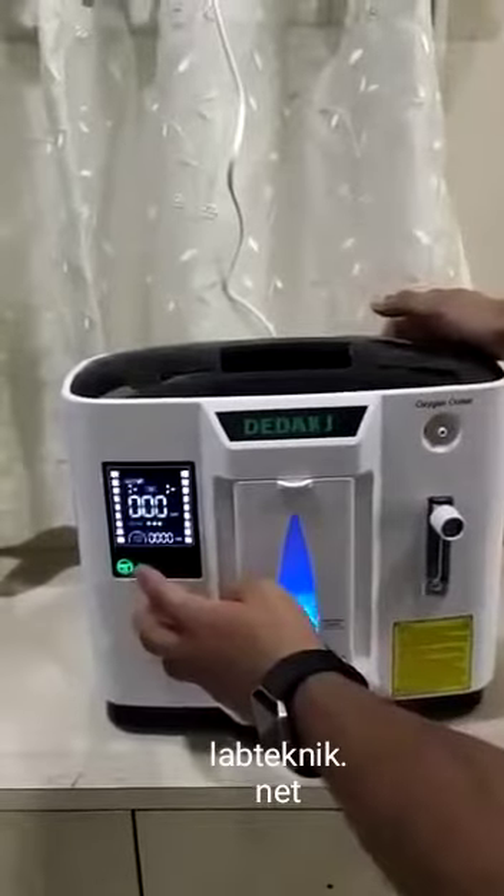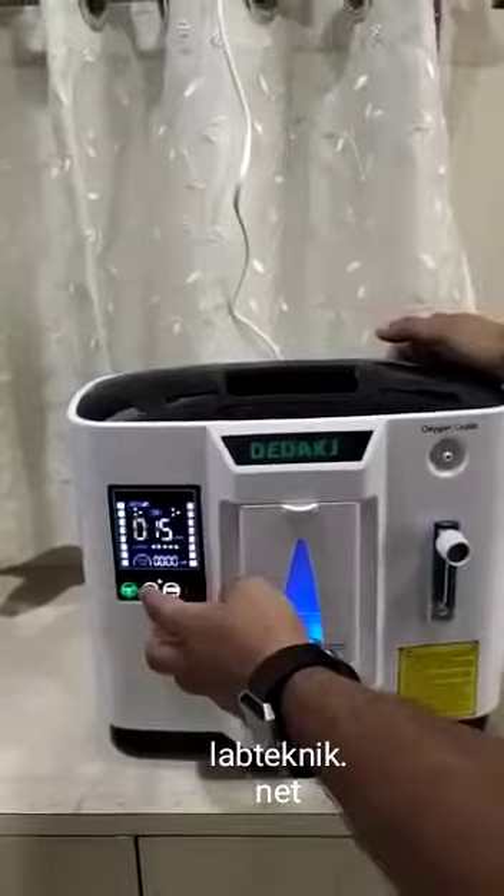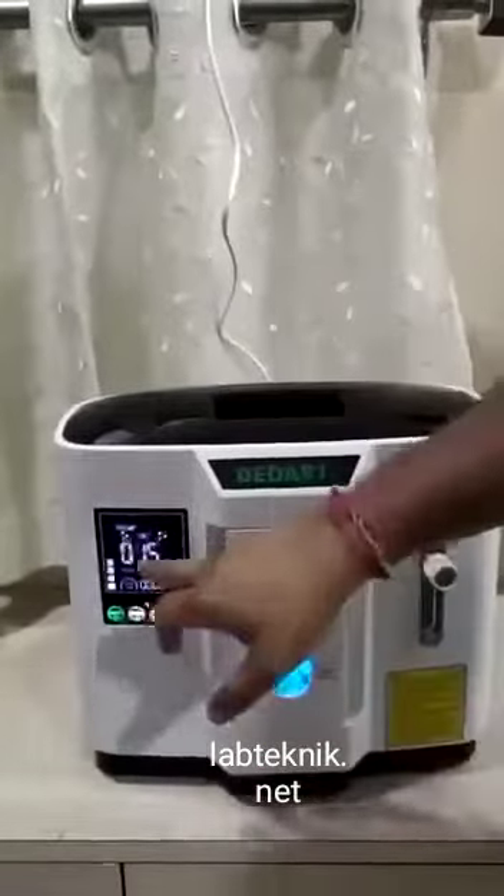These are the timers. It will be on for 15 minutes. If you want to increase, add another 15 minutes; if you want to reduce, subtract 15 minutes. So it works in multiples of 15 minutes.